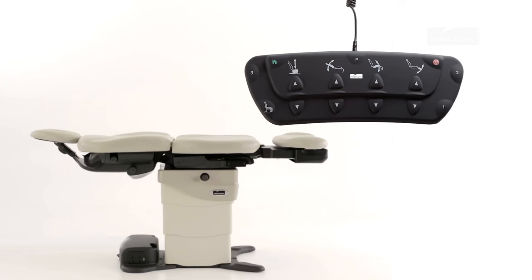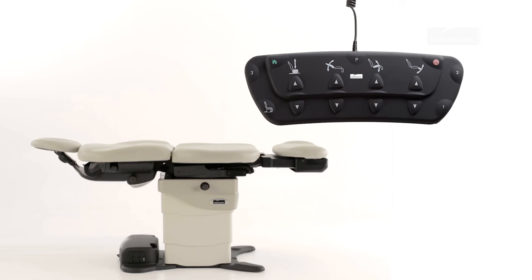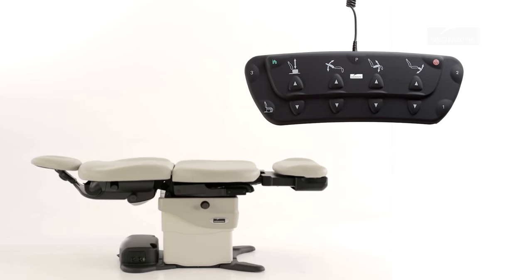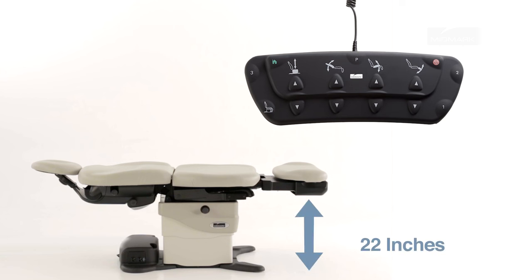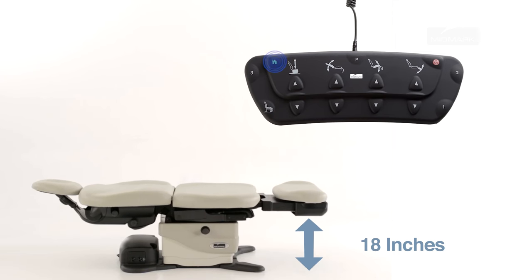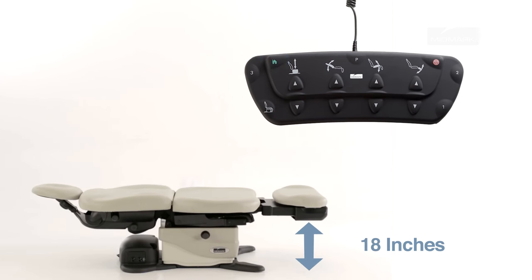The home function automatically lowers the table base so that your patient may get onto or off of the table. To lower the base to 22 inches, press and then immediately release the home button. To lower the base to 18 inches, press and hold the home button until you hear a single beep. Movement stops when the home position is reached, the active sensing technology is activated, or the stop button is pressed.